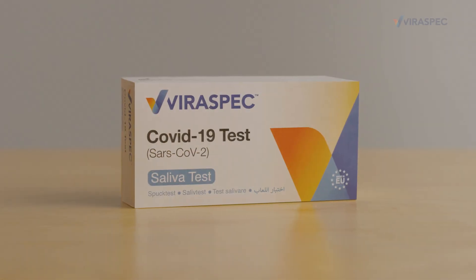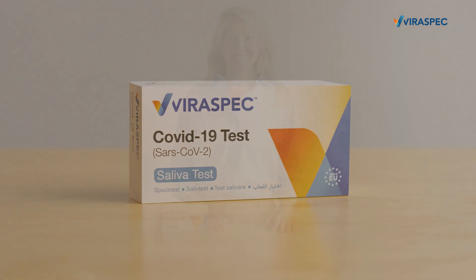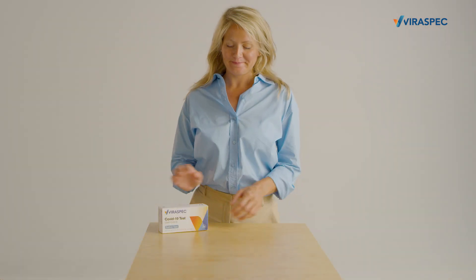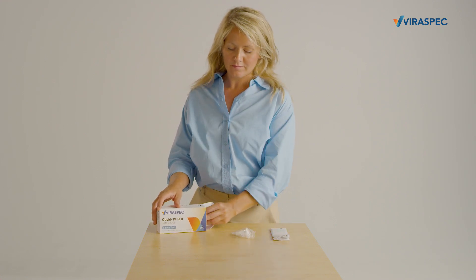The Viraspec Rapid Antigen Test is a simple self-test produced in Northern Europe, using your saliva to detect the COVID-19 virus. You get the result in 5 to 10 minutes — just follow the instructions.